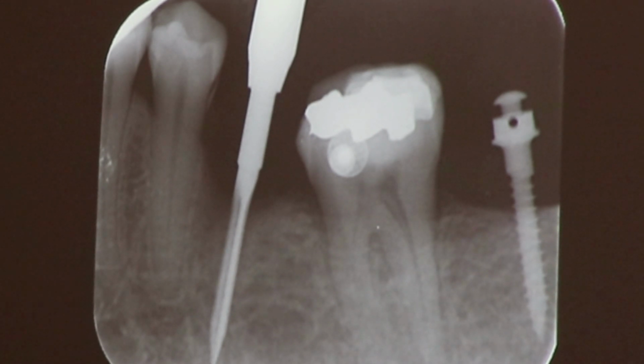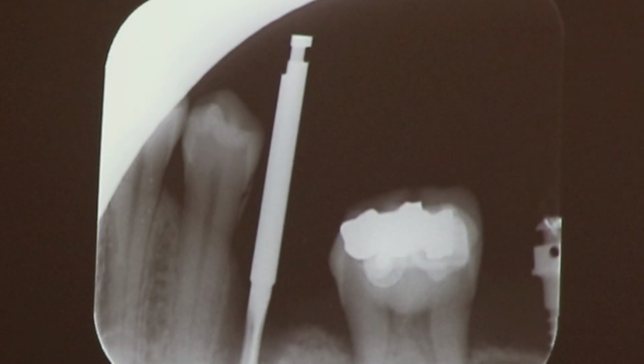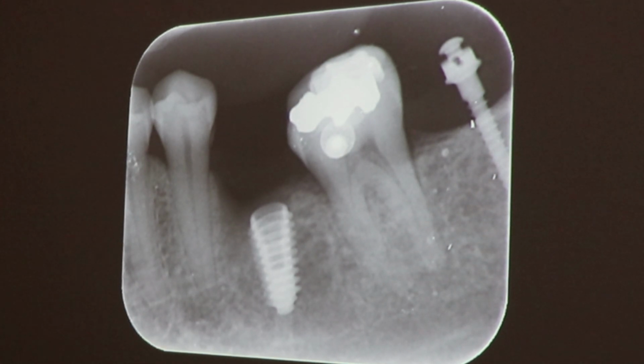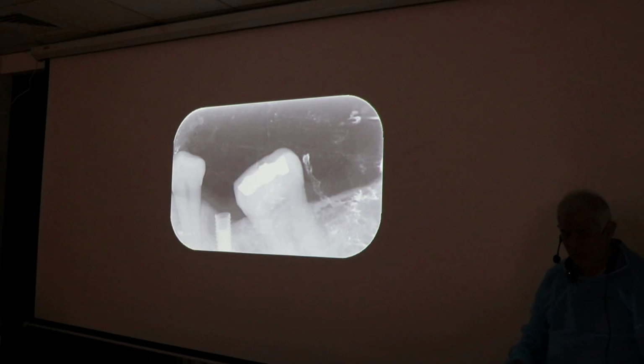It was, I think, 5 to 7, 2 millimeter. That's all we got. And we also did not allow this to go back. So the 7 millimeter crown was the way to keep it. Now this is not a mini implant. It's a standard 4 millimeter or maybe even more. It's a standard implant in a 7 millimeter gap.